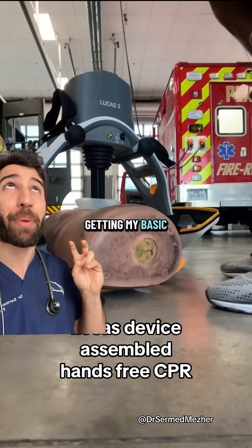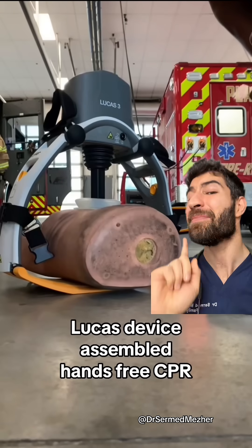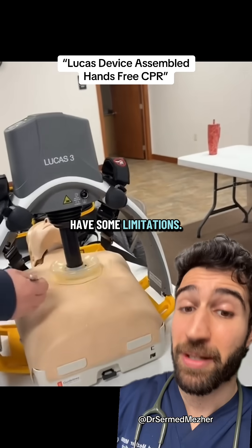Well, that was a waste getting my basic life support certificate — the machine could just do it for me. Not quite. Lucas is an impressive hunk of metal — well, he's actually carbon fiber — but he does have some limitations.